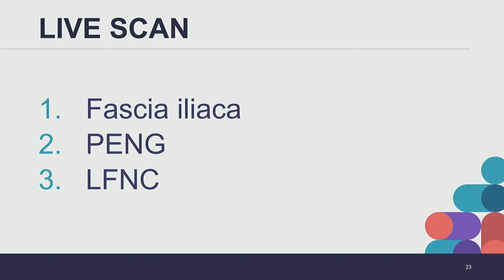So when in doubt, scan for the femoral artery first, as if you're going to do a femoral nerve block, right? Because you can see we're right in that same visual field. Then drop the depth, because when you're doing a femoral block, you're really just concerned about something superficial way up here. Then drop the depth even further until you drop down to this pelvic brim. And that's the target for the Peng block. So just start with that femoral artery first.